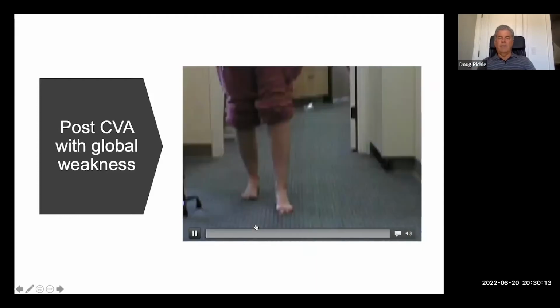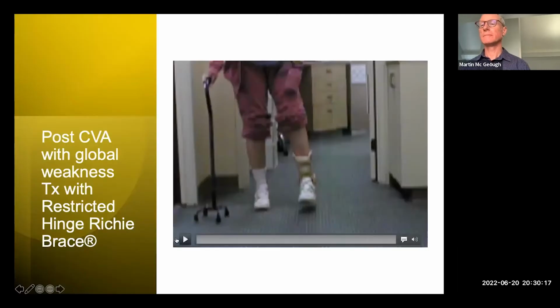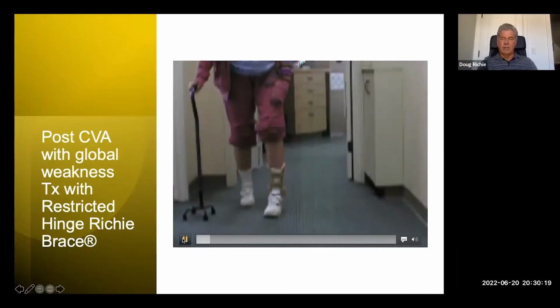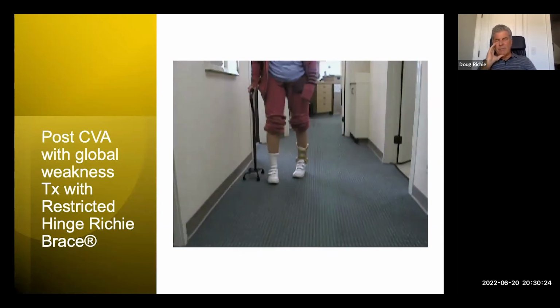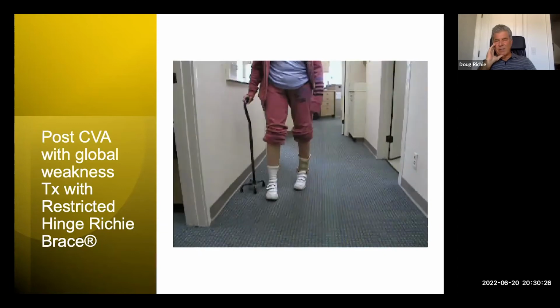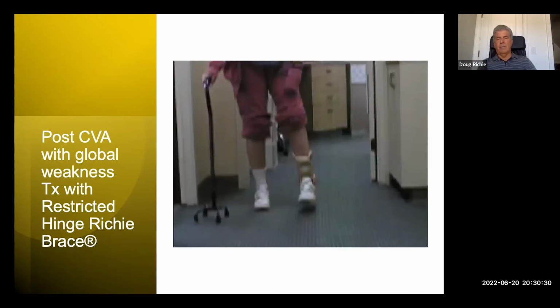An AFO isn't going to correct that. But what we can correct is the drop foot. And so this is an improvement of drop foot, but it does not correct the circumduction of the hip, which in her case, she was totally happy with.